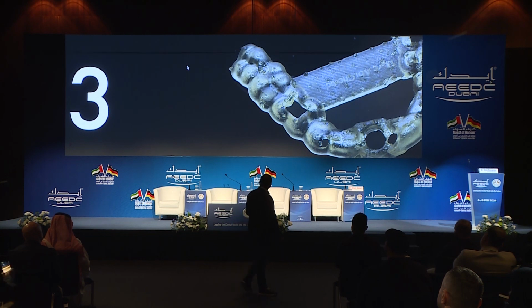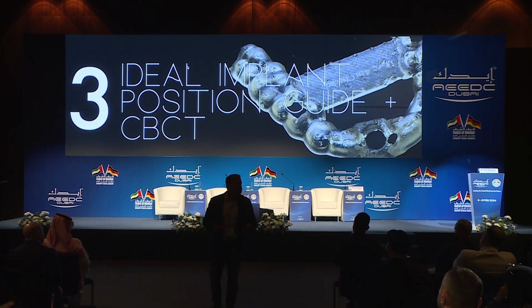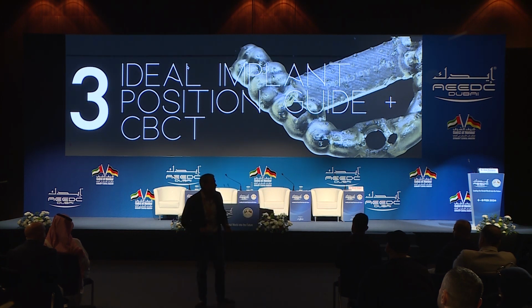Three, of course, today with the world of digital, this is not a magic bullet. It's not going to place the implant for you. It's just going to help you. It's a tool that will help you to do the right thing, to place your implant driven by prosthesis. You have the CBCTs and the guide today, it's a must. I always have guides on my tray. Sometimes I use them, sometimes I don't, but at least I have them, and I feel more secure when I have them.